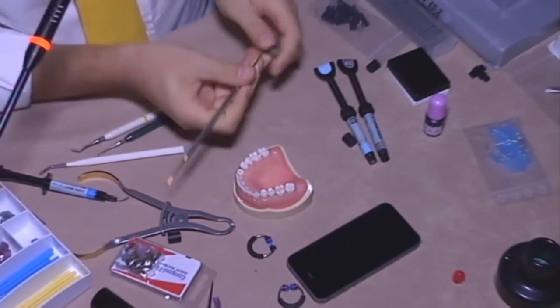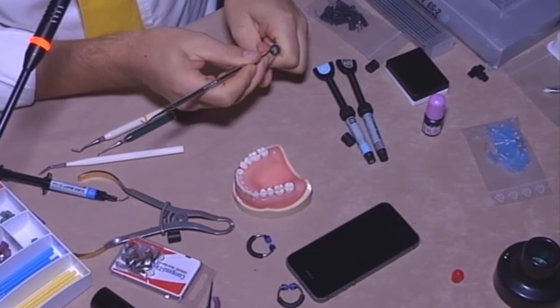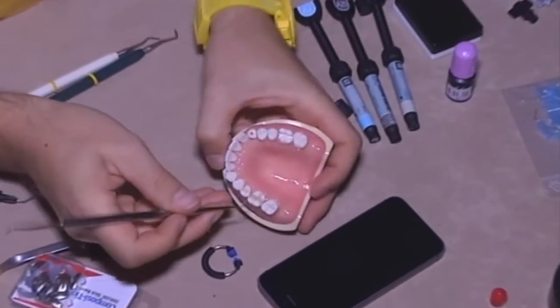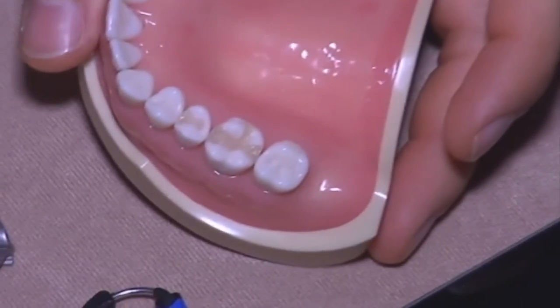If you already shaped the dentin layer, the enamel is easier to place because you already have a project to follow.